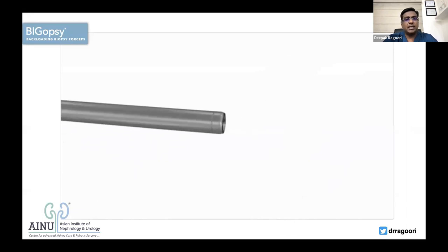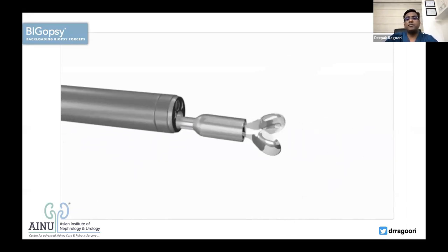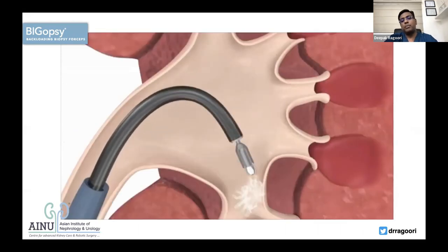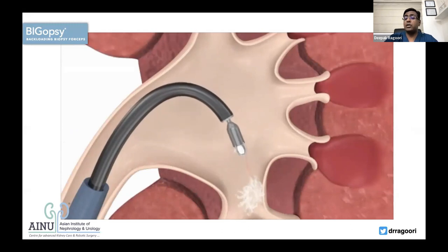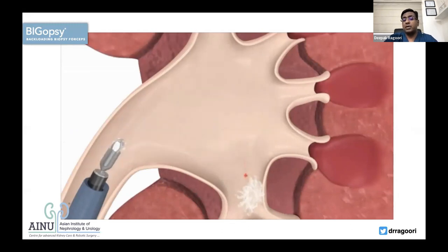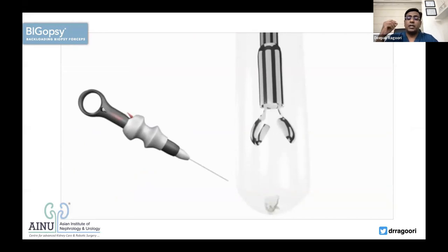Last but not the least, you should know about this accessory, that there is this backloading biopsy forceps to do your upper urinary tract biopsy of the tumors, where we use baskets actually to pull out a sample. But we can go one step further to have an accessory like this, where you can take a biopsy of upper tract tumors rather than using a snare or a basket to pull the tumors, which is much more traumatic, I feel.